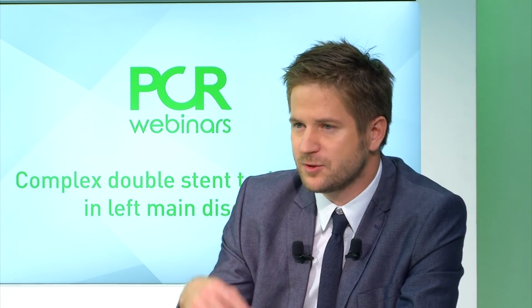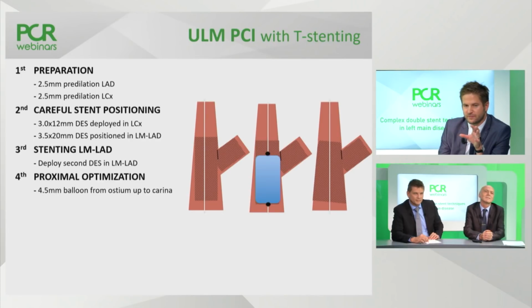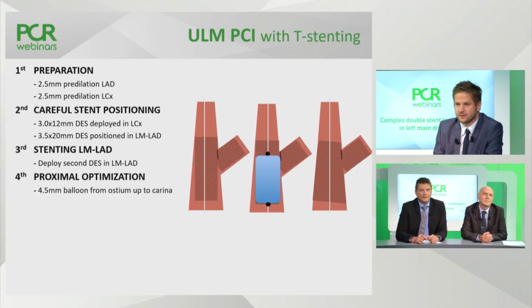So actually, your measure of the left main is based on this calculation, the Finet law: distal main branch plus side branch, multiplied by 2/3. So this is how you calculate the size of the left main. My question is, here we are facing a 3.5 LAD. With a 3.5 stent, normally how far can we go in the left main? What kind of mismatch can we still cope with using our regular stent?